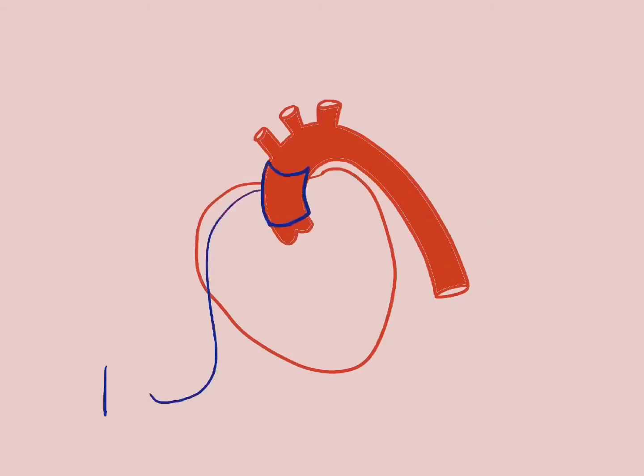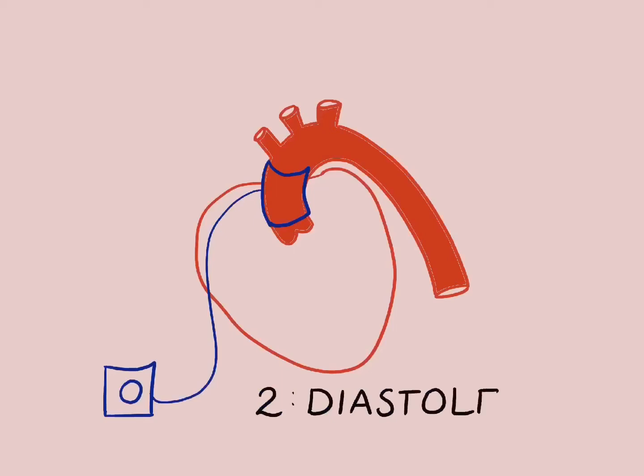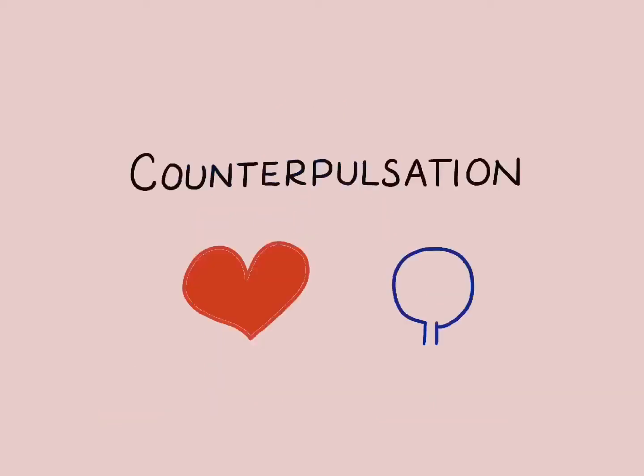So that's the intra-aortic balloon pump, which is the traditional device. A newer concept is that of the extra-aortic balloon pump, which is a cuff that wraps around the outside of the ascending aorta and connects to an external driver. Much like the other balloon pump, it's going to allow for blood flow during systole, but then during diastole, there's a balloon housed within that cuff that's going to inflate on the aorta and push some blood flow forward and also increase that coronary perfusion.